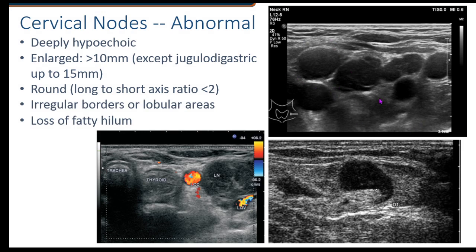Here we have a very rounded appearance to these lymph nodes — they look very abnormal. We cannot make out the hilum too well on this one. This one still has a little bit of its shape, but look how rounded and how deeply hypoechoic these lymph nodes have become. Looking at this lymph node down here — it still has a hilum, but look how thickened this cortex has gotten. This would be very suspicious for metastasis, that there is some cancer inside this lymph node. There seems to be another abnormal lymph node over here as well, but this one is really grossly abnormal with that thickening of the cortex.